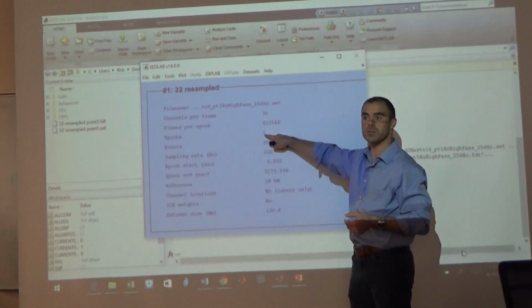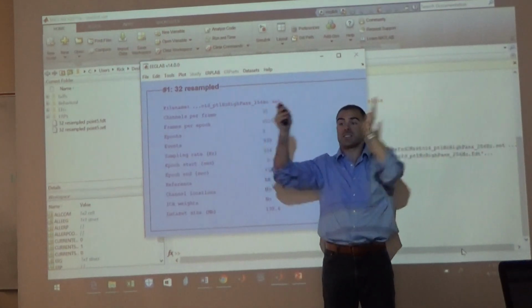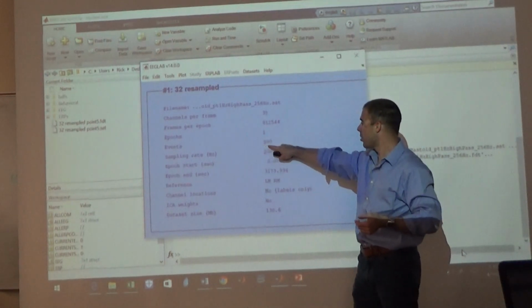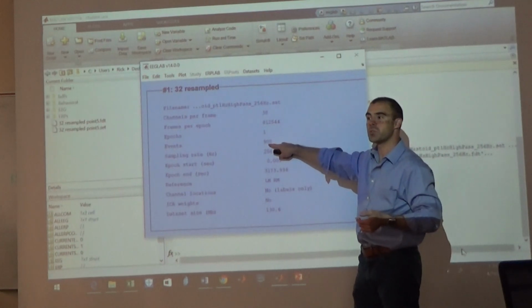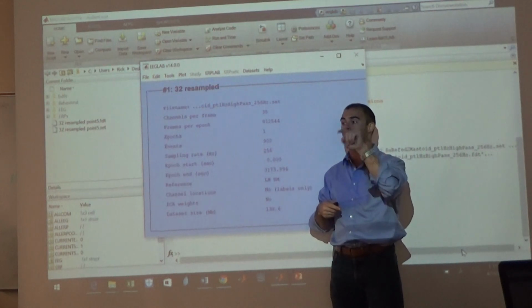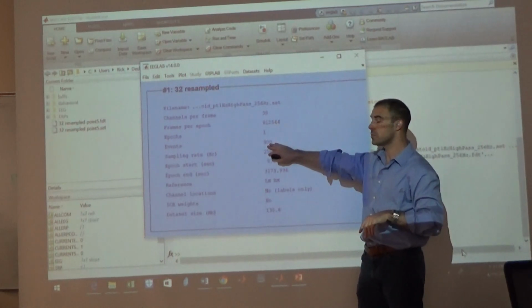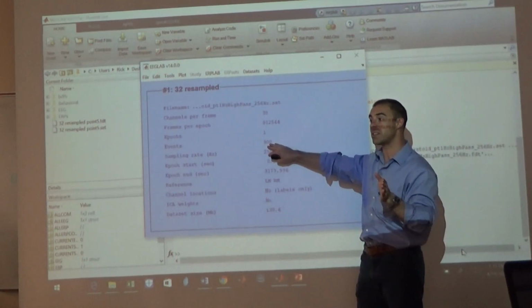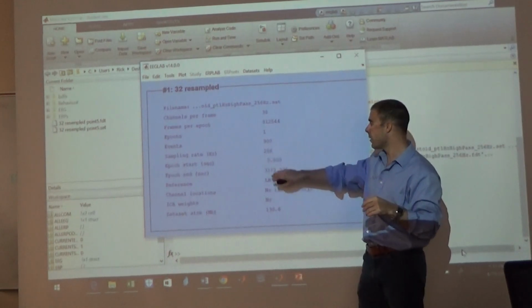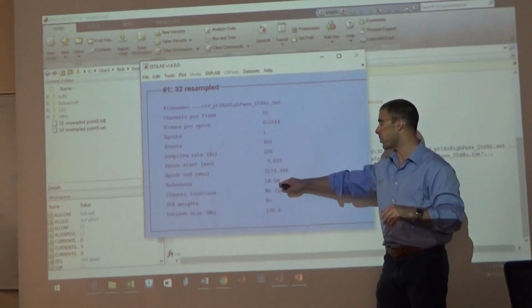We have one long epoch. You guys remember what an epoch is? So what this tells us is that there's one long EEG recording. It's not sliced and diced yet into different ERPs. Okay? So you have one epoch of 900 events, because we had 300 trials when something came on the screen and in which somebody made an item memory judgment and a source memory judgment. Okay? So that's 900 things in terms of codes that were sent into the data as events. It tells us our sampling rate is at 256 hertz, and it tells us our reference electrodes are the left mastoid and the right mastoid.